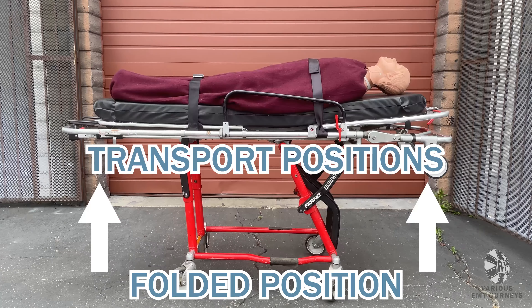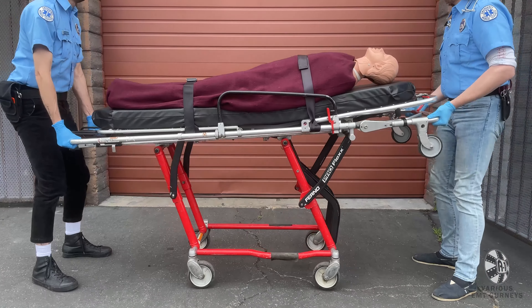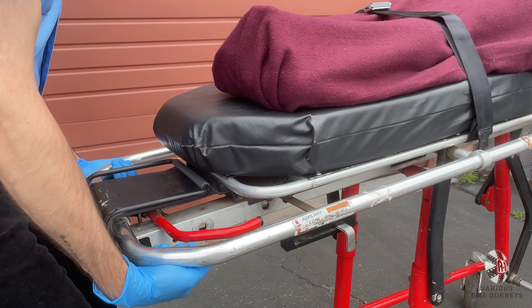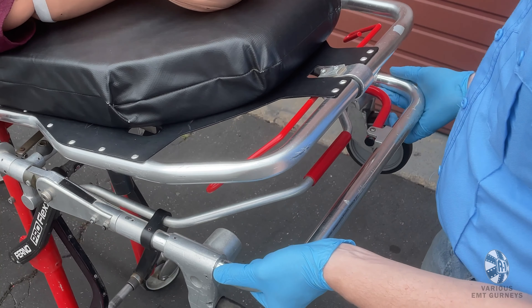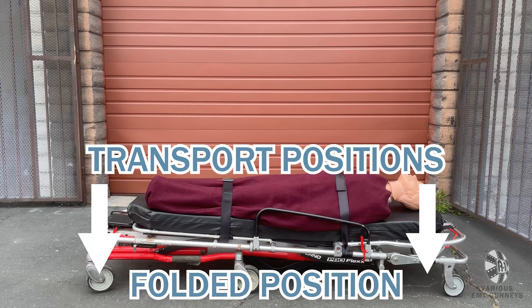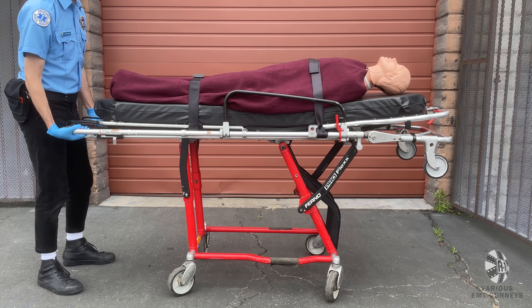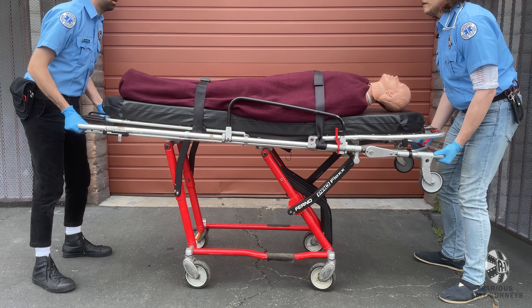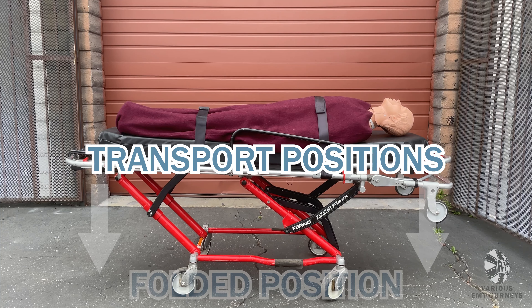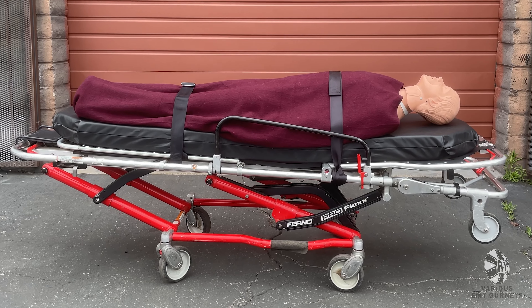To switch from the folded position to one of the transport positions, you will first need to switch to the loading position, then follow the steps just covered. If you are trying to switch from the transport position to the folded position, note that many customers have this issue: you cannot switch directly from a transport position to the folded position. If you try to push the gurney down all the way, you will be unsuccessful, so please don't force it.